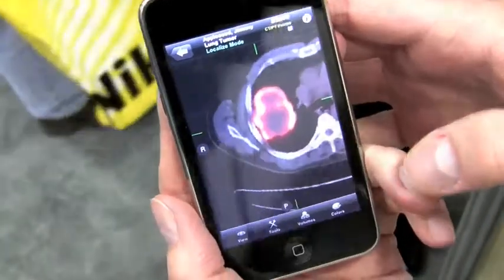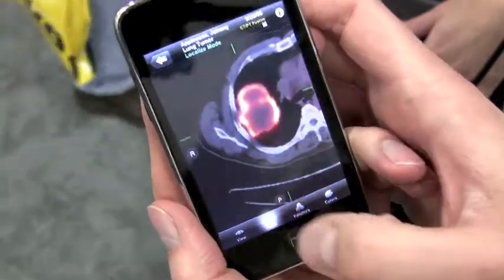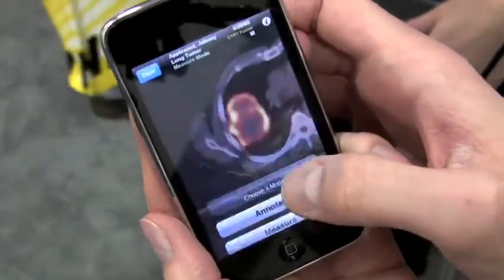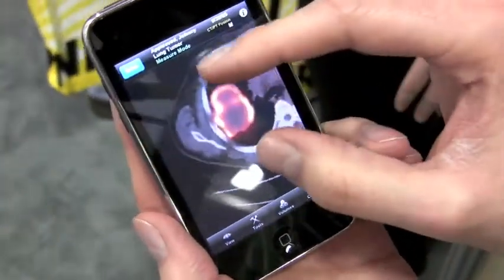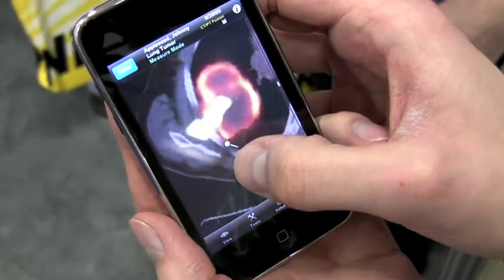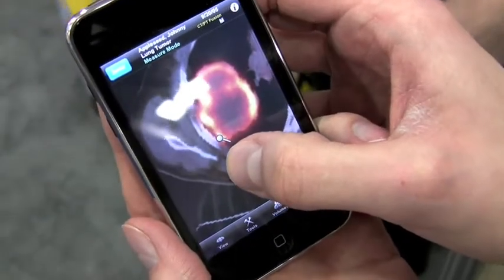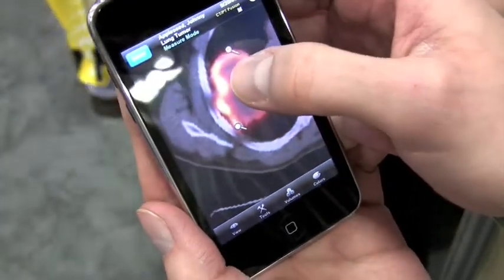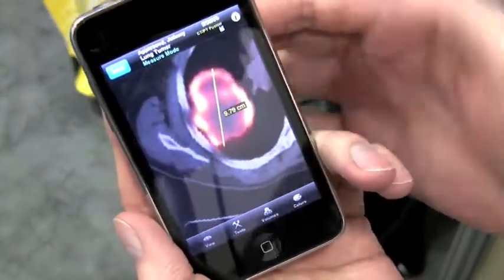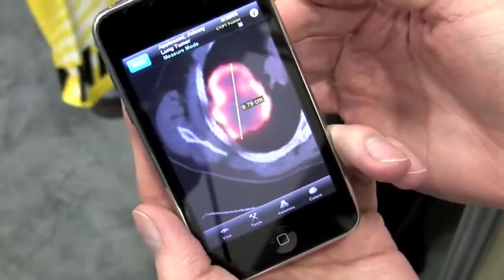We have other tools as well, like measurement. I could make this tumor here large and place the endpoints of a measurement line. And here you see that it's about 10 centimeters.